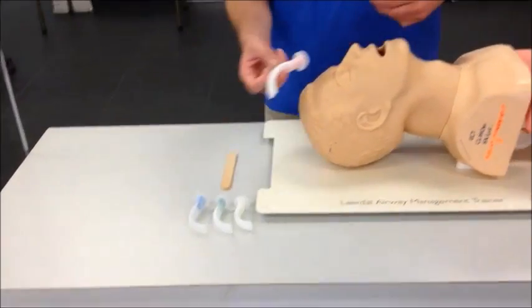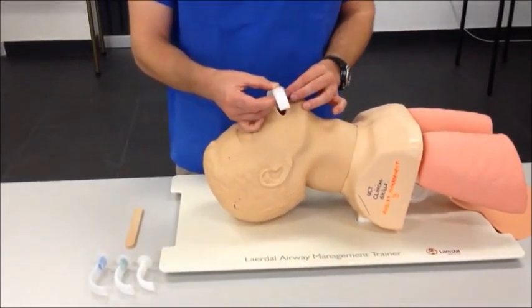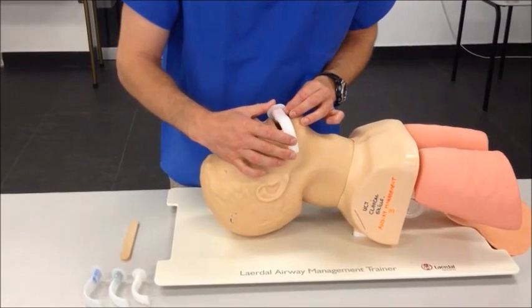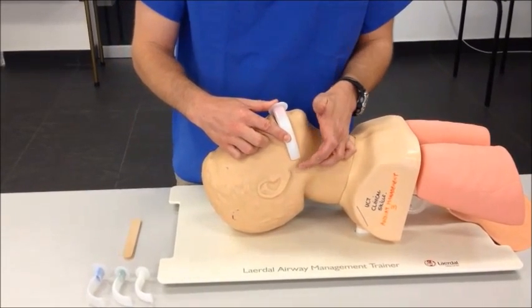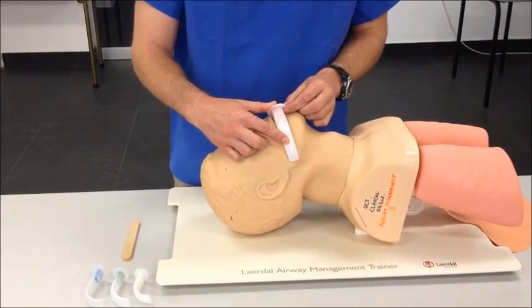The best way to size your device is to lay it from the middle of the mouth — the end of the OP airway should then reach or just go beyond the angle of the mandible.